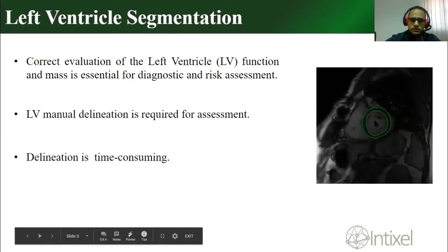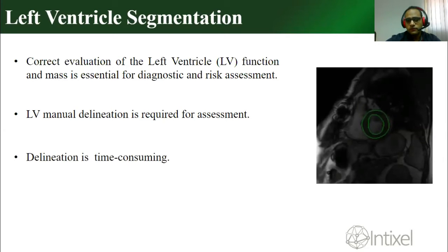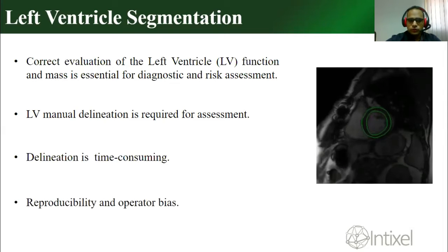And actually, this is a very very time-consuming task because the operator has to sit down in front of many images per case and go through all of them to select just a very small subset and then start drawing on them with his mouse, connecting these green dots. So it's a very time-consuming task. Also, it has another issue, which is that it's not reproducible.